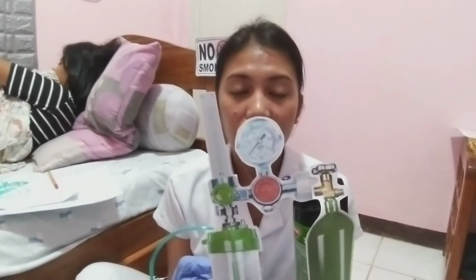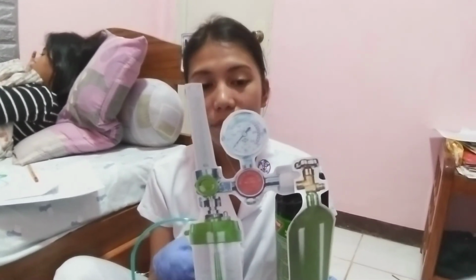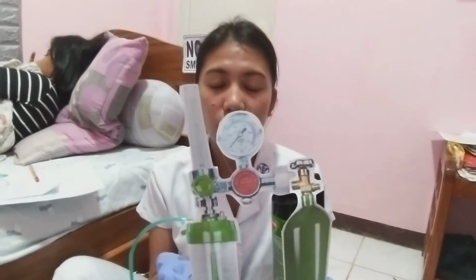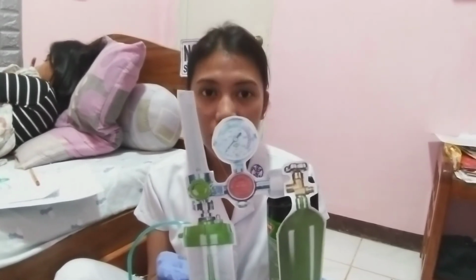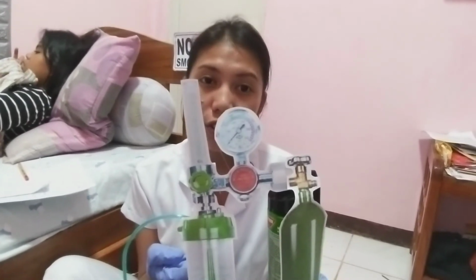Now I have already set the flow rate, which is 2 liters per minute, and I have also set the oxygen concentration to 26% with a continuous duration. Elevated levels of oxygen in the patient's body can depress the stimulus to breathe.